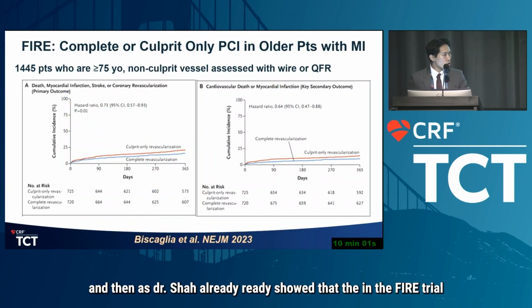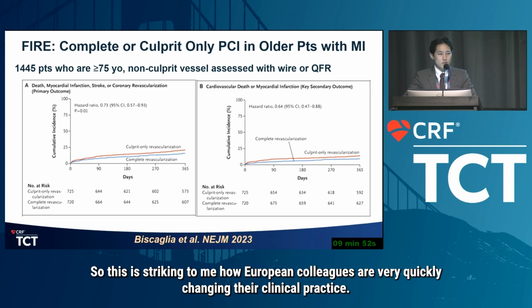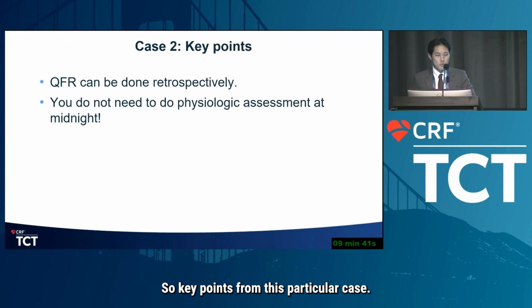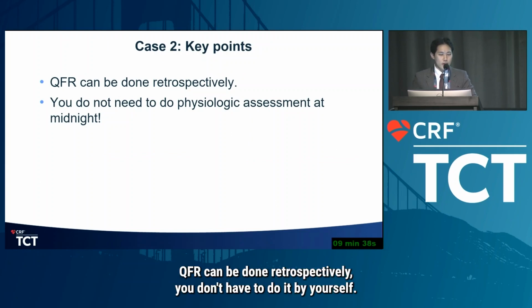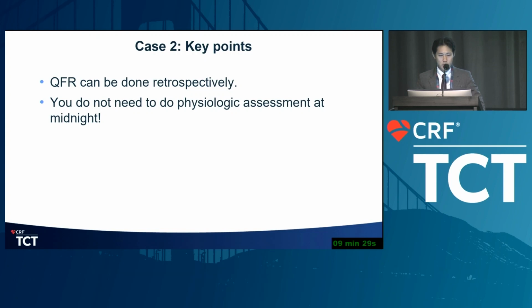And as Dr. Shah already showed, in the FIRE trial, actually one third of the patients who get physiologic assessment in the STEMI setting are done by QFR. This is striking to me, how European colleagues are very quickly changing their clinical practice. So why not in the United States? The key points from this case: QFR can be done retrospectively, you don't have to do it by yourself, and clearly you don't need to do physiologic assessment at midnight or on Saturday daytime.